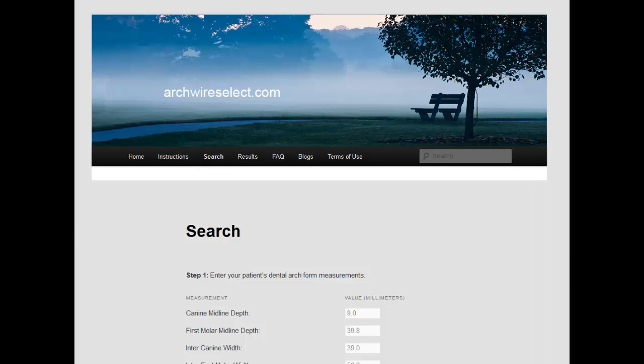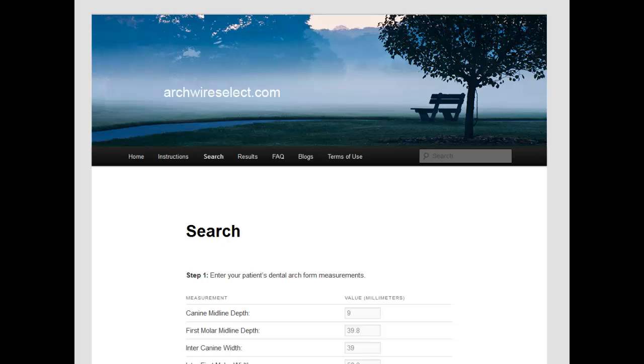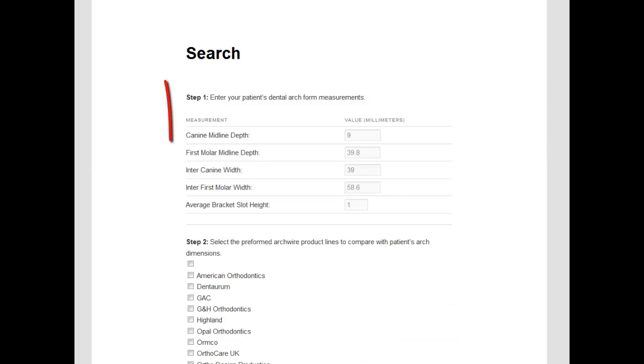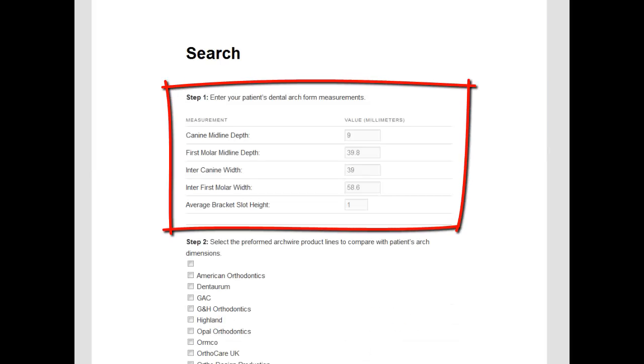The search form is divided into four data entry sections. In the first section, we enter dental arch form measurements — width and depth — as well as orthodontic bracket height.